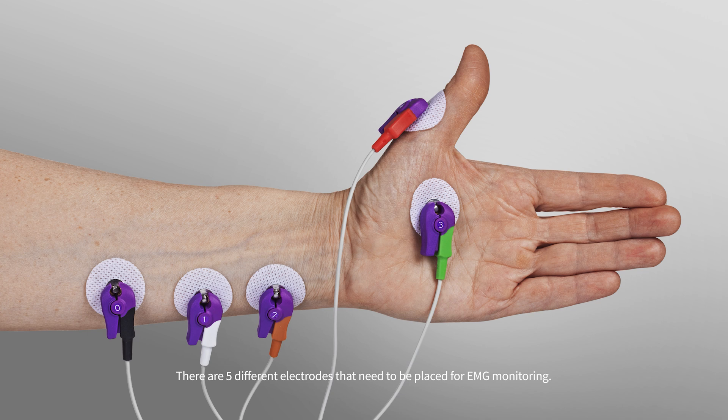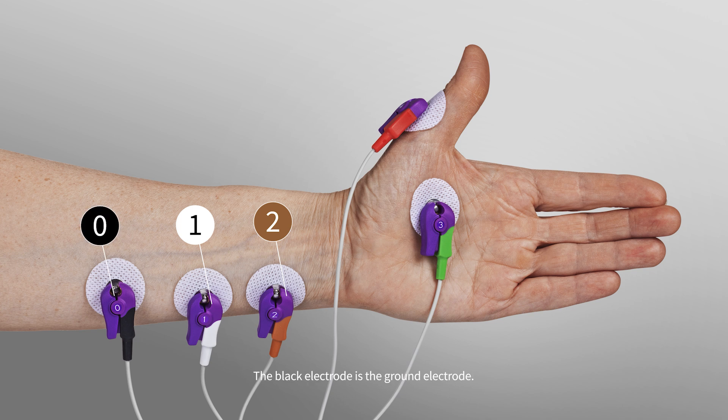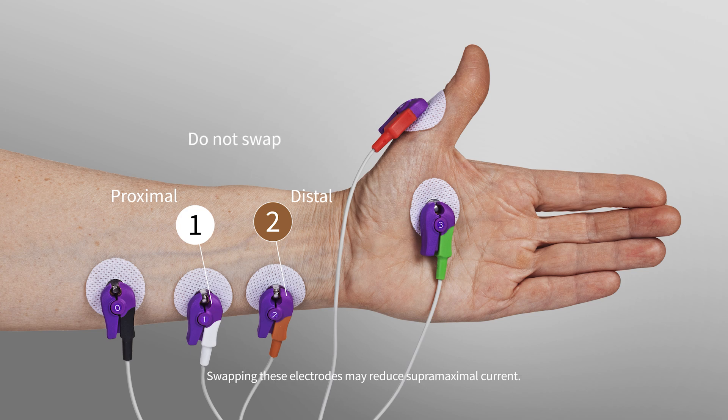There are five different electrodes that need to be placed for EMG monitoring. The brown and white electrodes are used for stimulation. The black electrode is the ground electrode. The red and green electrodes are the measuring electrodes. Note: always keep the brown electrode distal and the white electrode proximal. Swapping these electrodes may reduce supermaximal current.